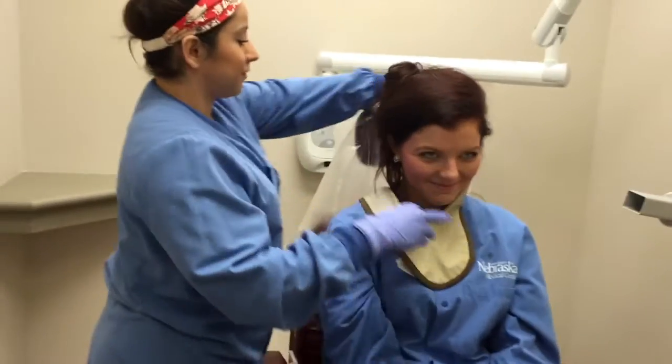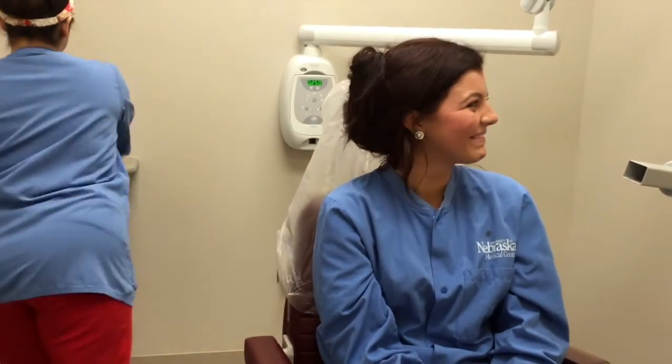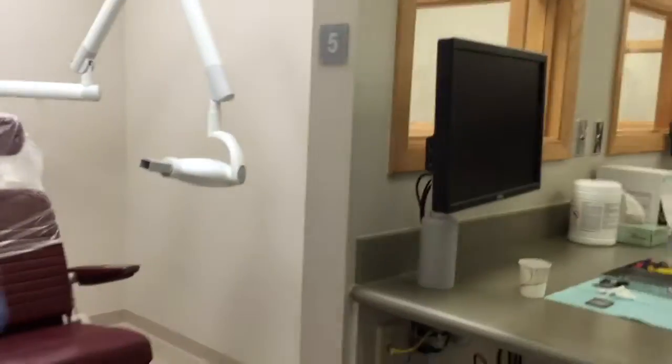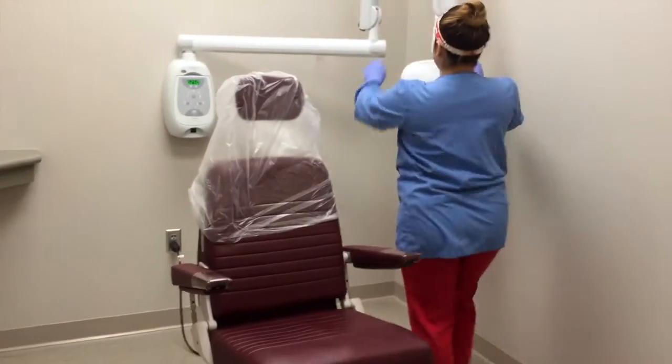Aseptic measures must be taken when tearing down the operatory. Be sure to take the thyroid collar off the patient and de-bag the unit. Cavi wipes can be used to clean the unit.